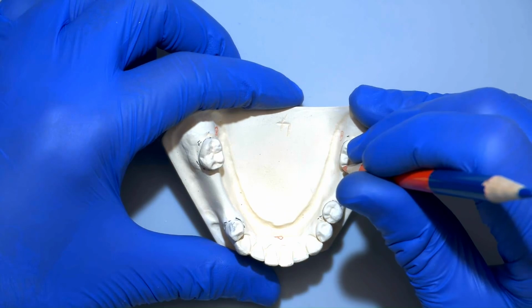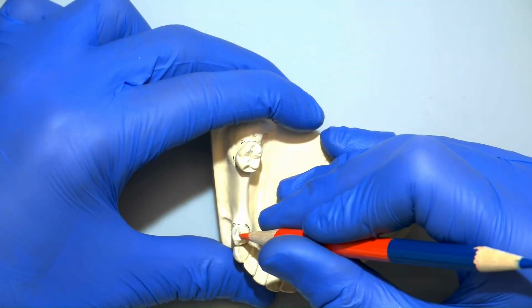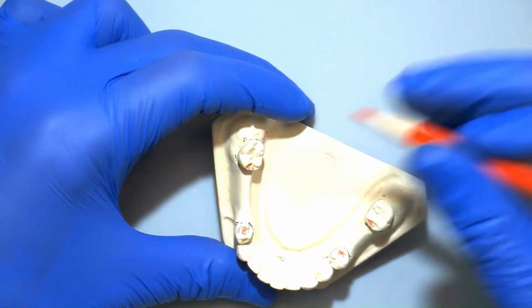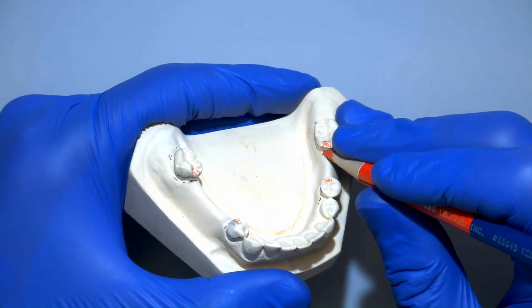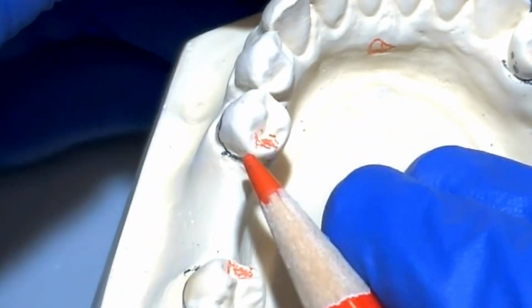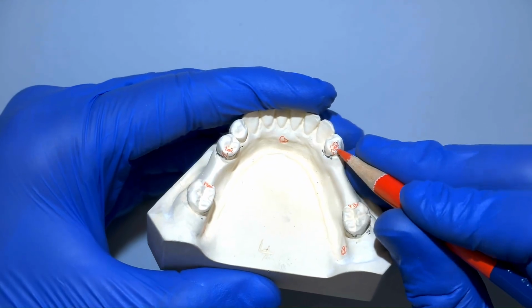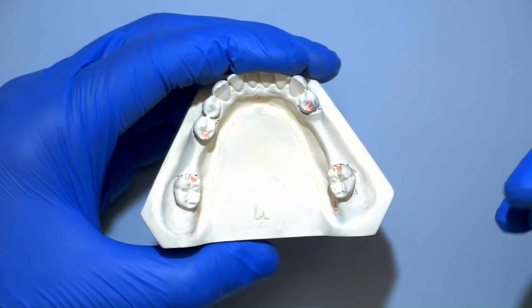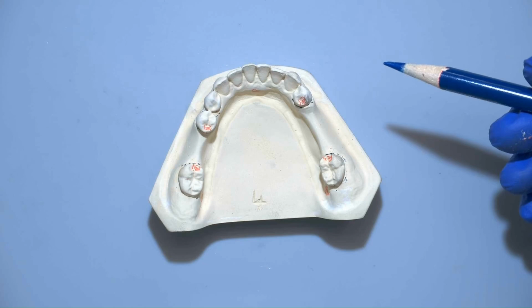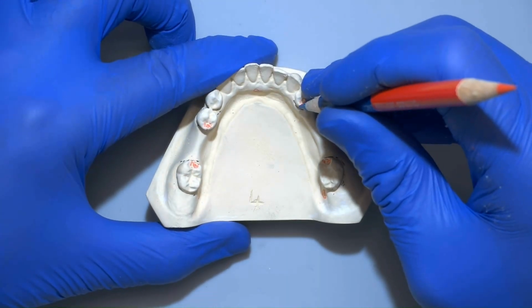We will start by drawing our rest seats in red. The next thing to do is to draw the areas of the guide planes. Red denotes areas included in the mouth preparation. That includes areas like guide planes and undercuts that are going to be added or adjusted on the patient's mouth. We'll start drawing the occlusal rests. These are just outlines on the occlusal rest seats.